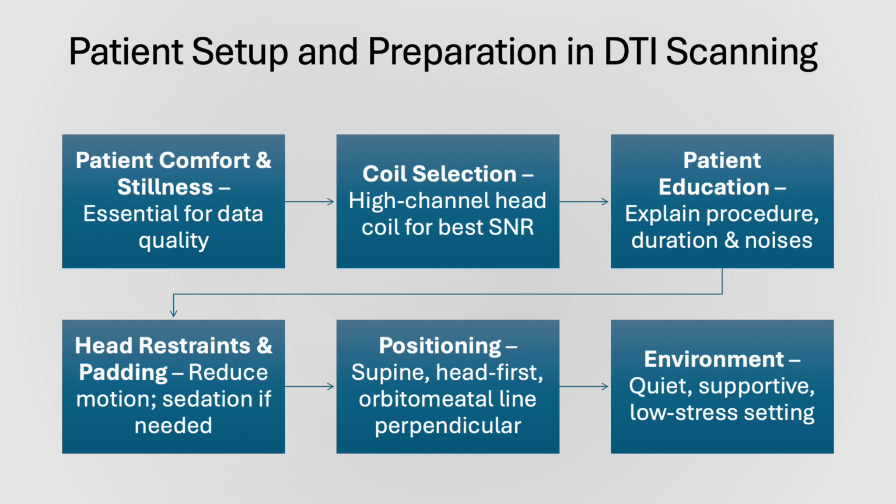So here is just a few tips on how to actually set up the patient. So in DTI, we are looking at the very subtle directional movement of water molecules. And this means that any movement, even slight movement, can seriously degrade the image quality. So we'll start by making sure the patient is comfortable, warm, and well supported so that they can remain still.